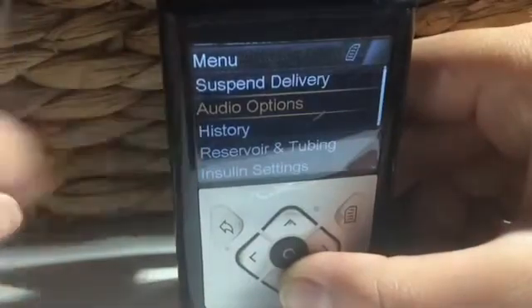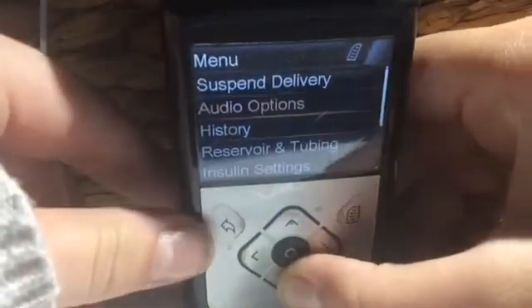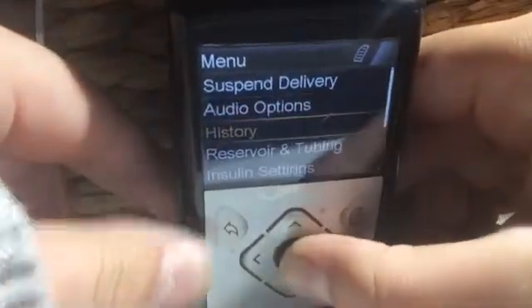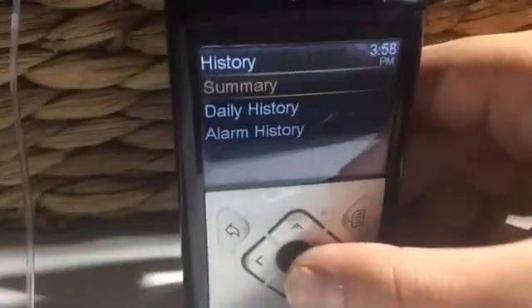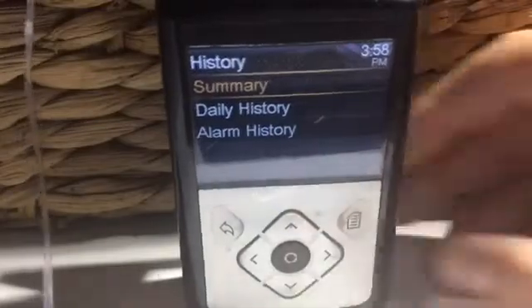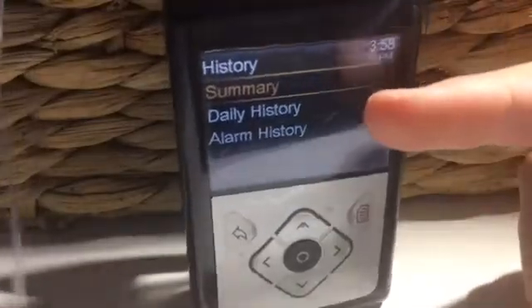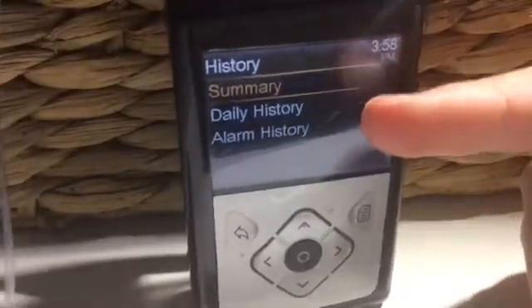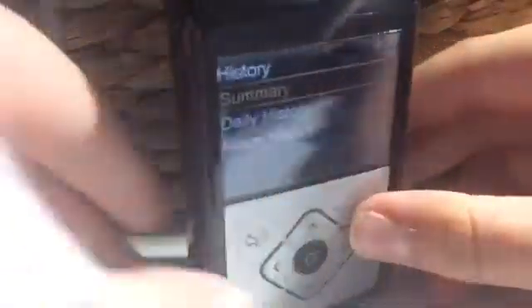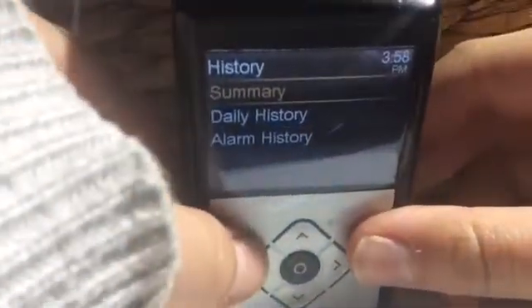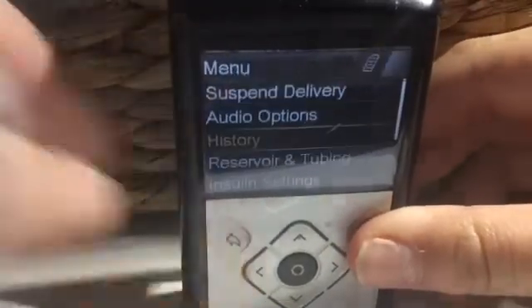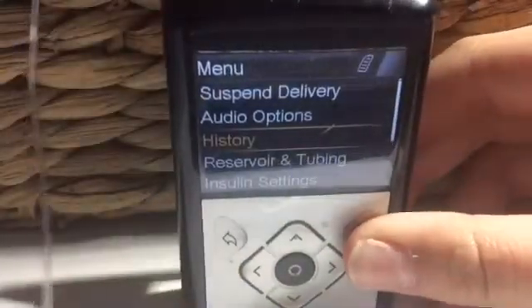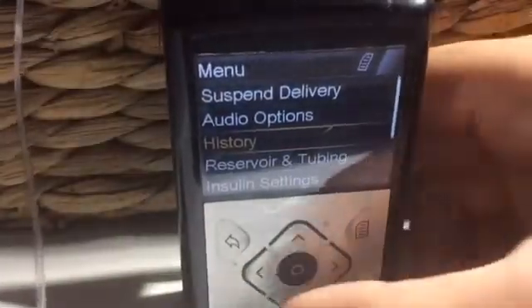Next, history. The history symbol shows you everything that you have done throughout the day — your BGL, your alerts, and what you've been given. This feature is so useful if you forget something or if you just want to know something.